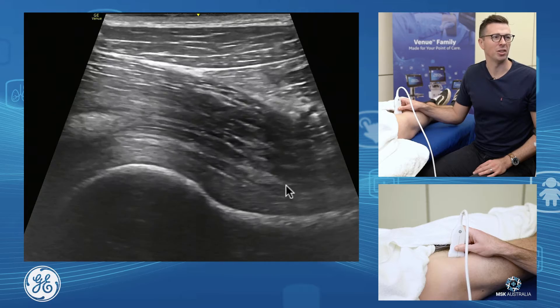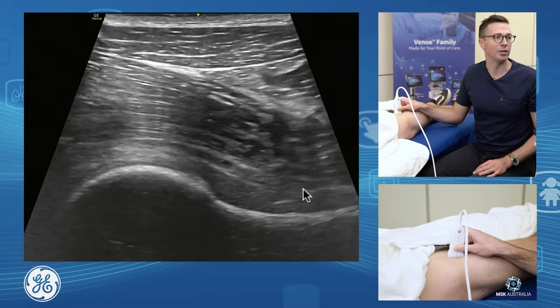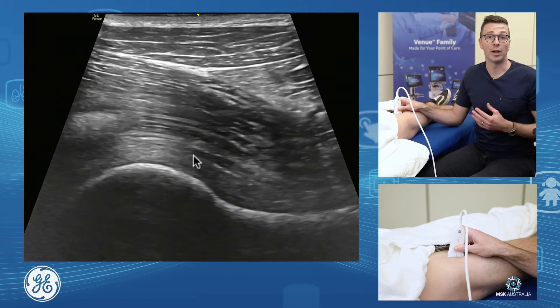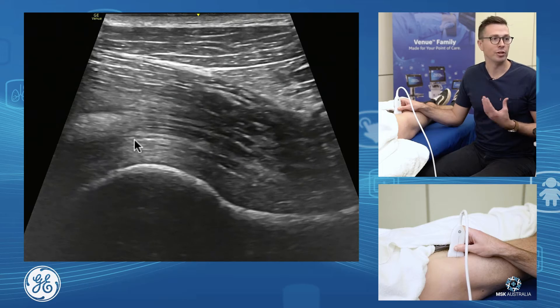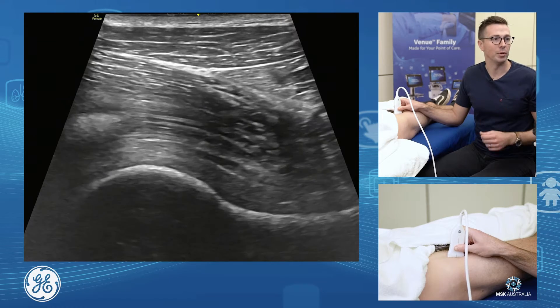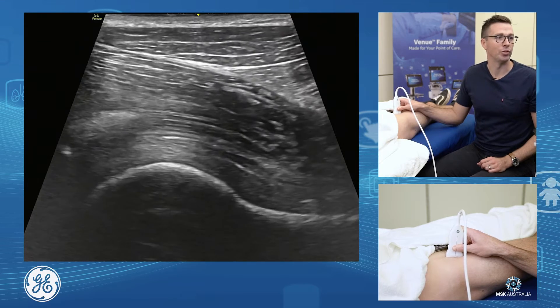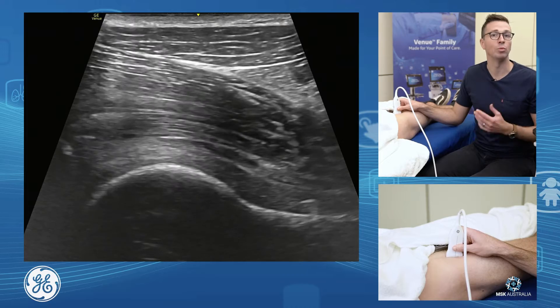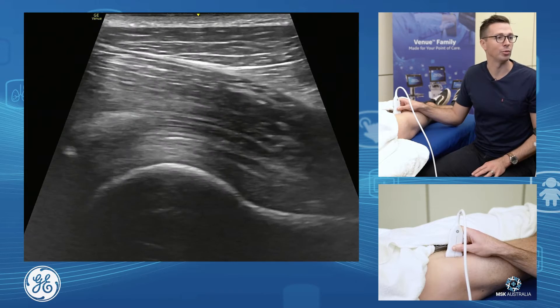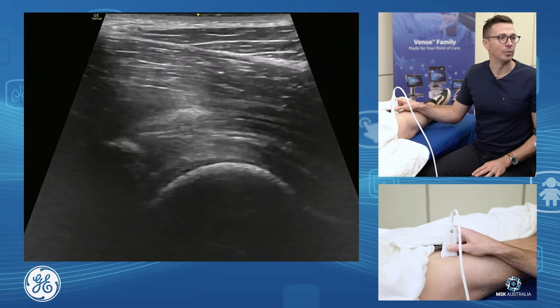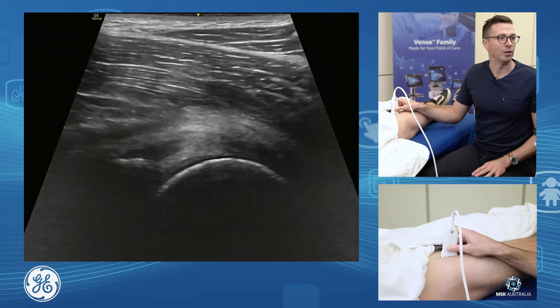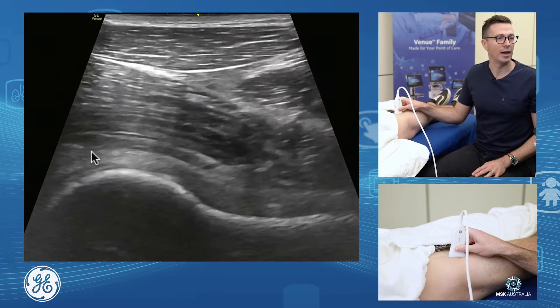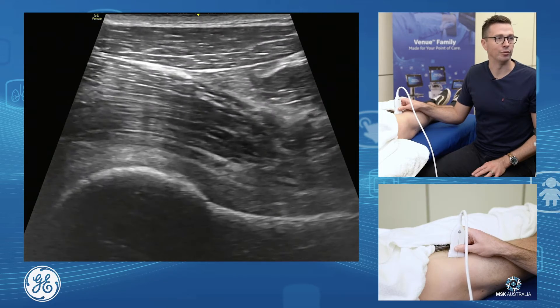The capsule anteriorly is the anterior iliofemoral ligament. So if you were to have a joint effusion, this is where it would be. If you were to have joint synovitis, this is where it would be — within the joint capsule itself. We can have a limited assessment of the anterior labrum and the joint itself.